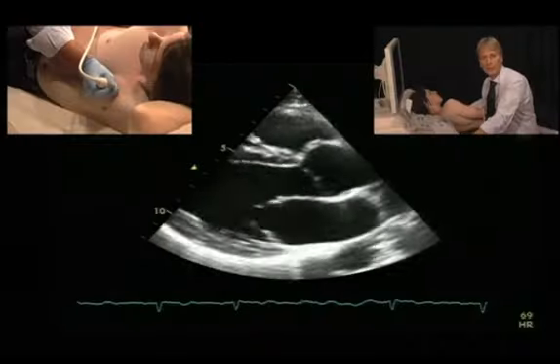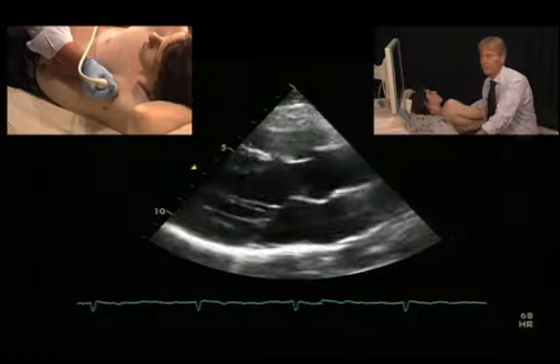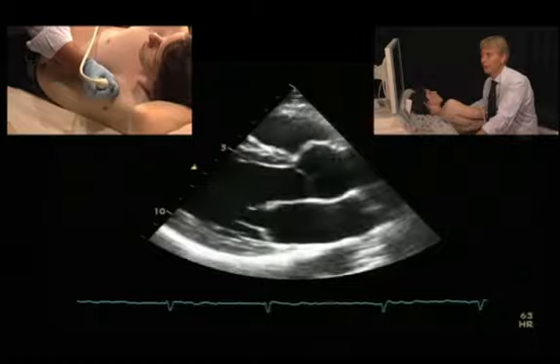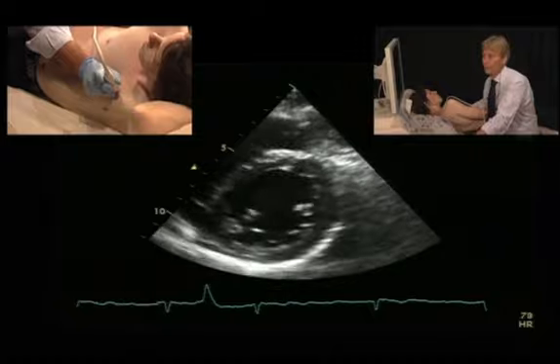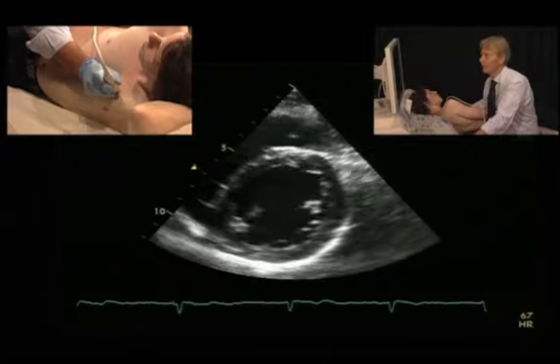To perform an M-mode measurement of the left ventricle, you need a parasternal long or short axis view. You can actually do it from both. I will show you how to do it from the short axis. So the first thing you have to look into is if the ventricle is really round. This is important for the reasons already mentioned.